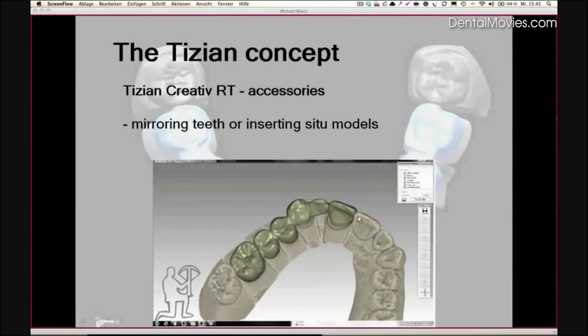Also, time saving is a very good option of the copying. That means a patient which has half of his natural tooth lost, it is possible to just copy that area here, the natural dentition, to the other side and have a complete, like a mirror effect, to have a complete copy of the symmetry of the existing teeth to the side which should be replaced or repaired with prosthetics.